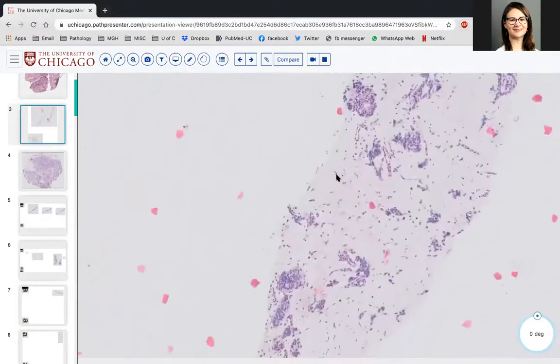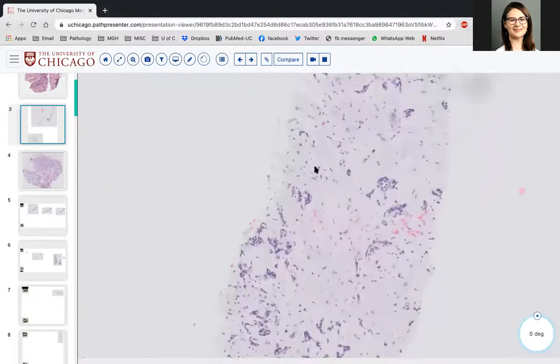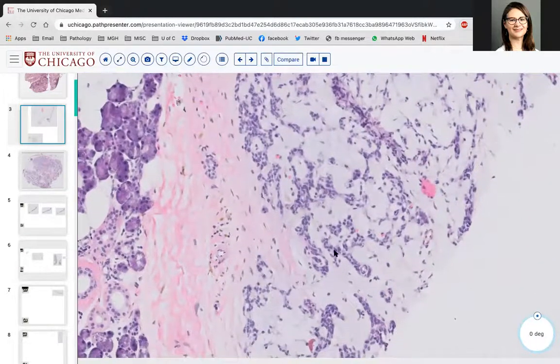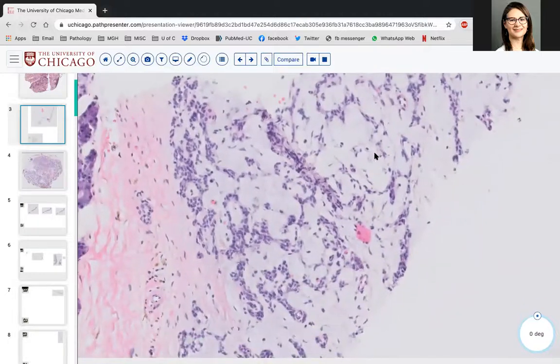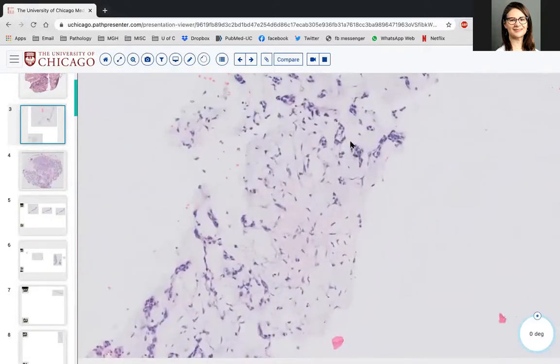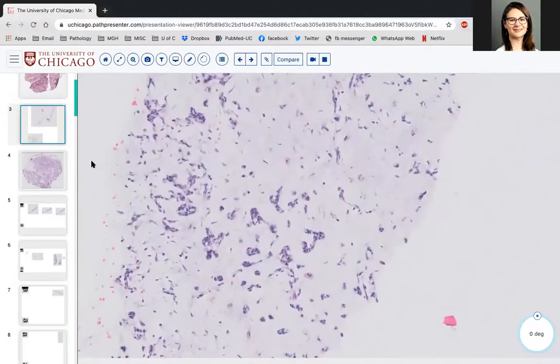So as long as you think this is a low-grade salivary gland neoplasm, that would be all that is needed on a diagnostic line for a core biopsy. So: low-grade, presumably biphasic salivary gland neoplasm, low-grade myoepithelial or stromal rich salivary gland neoplasm, perhaps favoring PA in the comments. Because again, as you'll see in another case, these diagnoses can be very challenging on core.